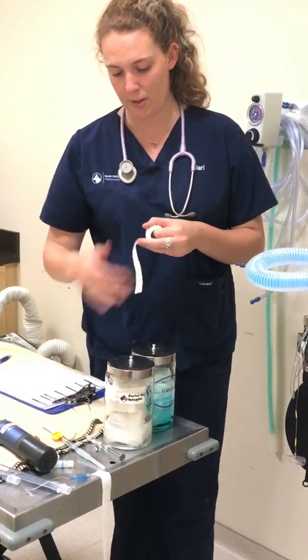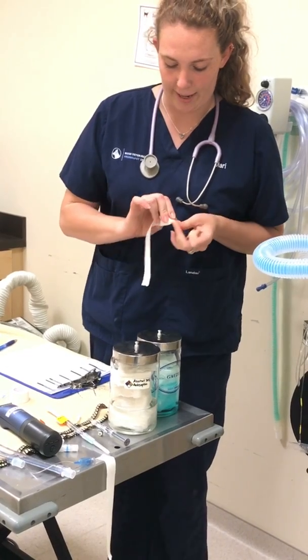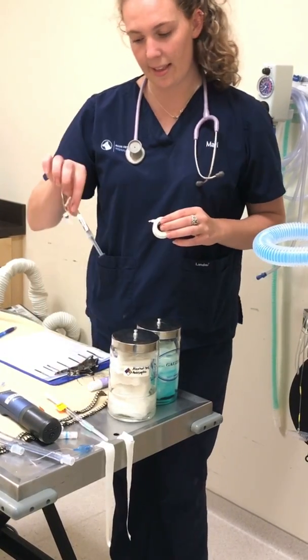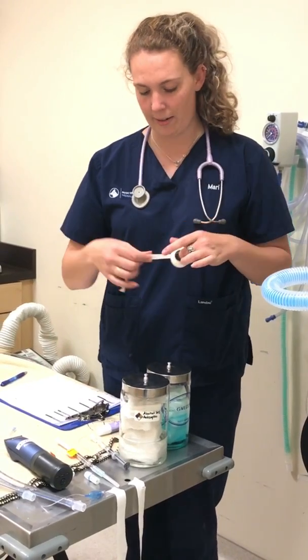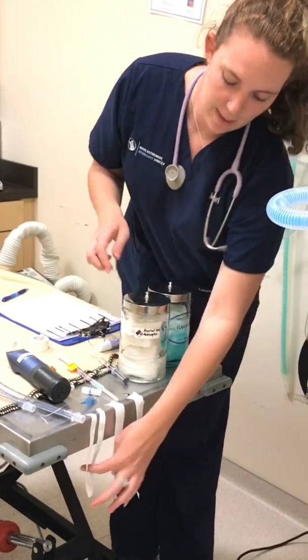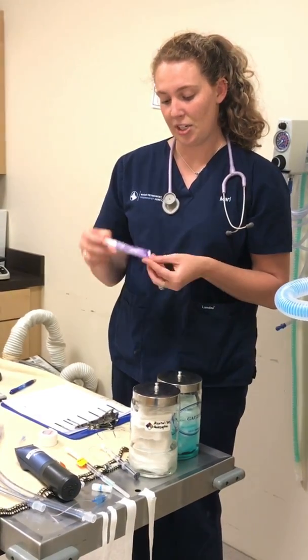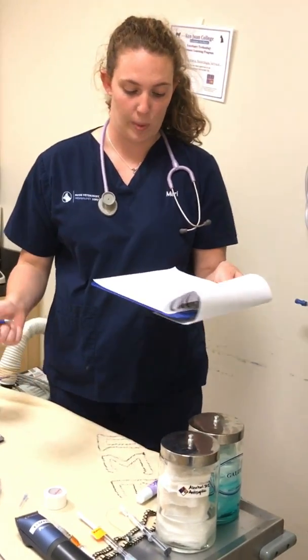I've got my clippers for clipping the area of our catheter. I've got my aseptic chlorhexidine scrub as well as alcohol. Got a T-set that's been preemptively flushed with our heparinized saline. And I've got a cap here to place on the end of our catheter. As you can see, I've gone ahead and torn the appropriate size and types of tape for securing our catheter. I've got some eye lube to place in her eyes after induction, as she will no longer have the blink reflex.